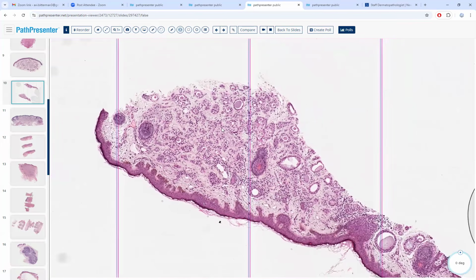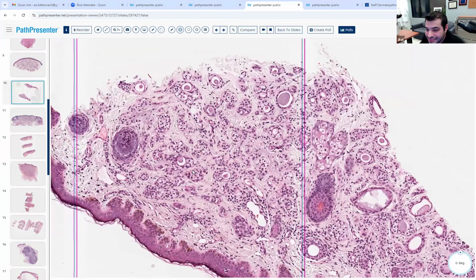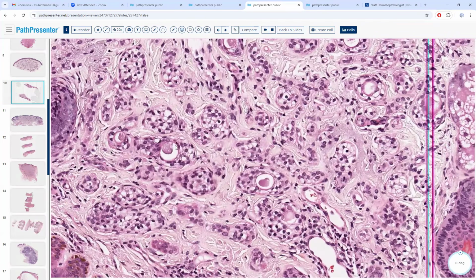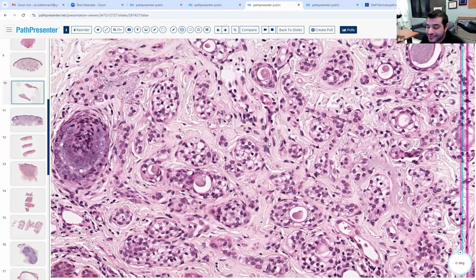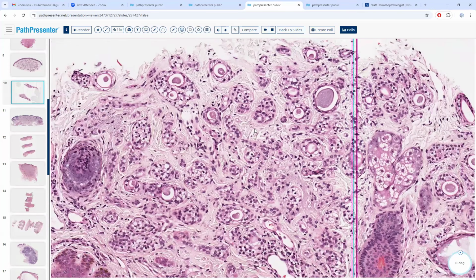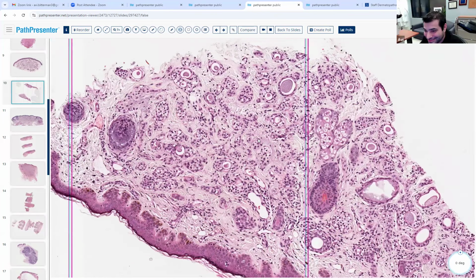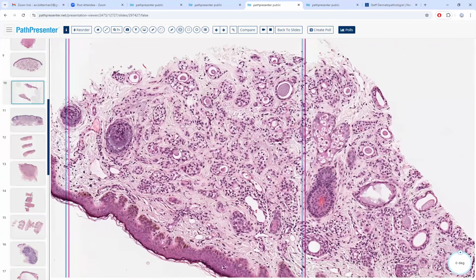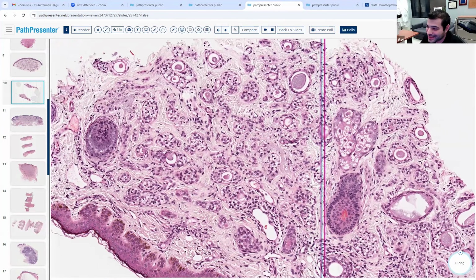I feel like there are some clear cells. Okay. Are they clear cells? Because I feel like they're looking pale from the low power. Yeah, they are clear cells. And then I think there's some type of syringoma called clear cell syringoma. I think you see that more in diabetes. Yeah, there is an association between clear cell syringomas and diabetes.